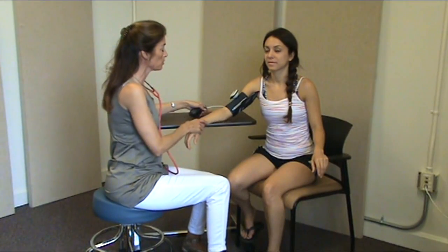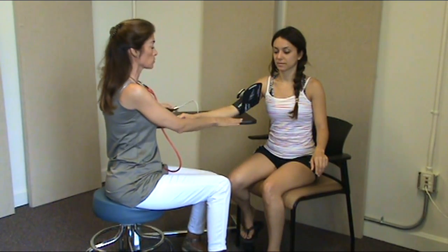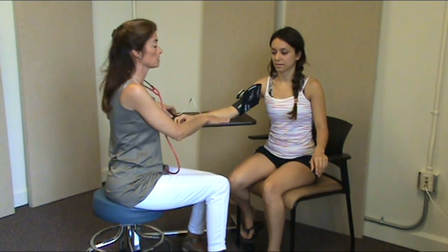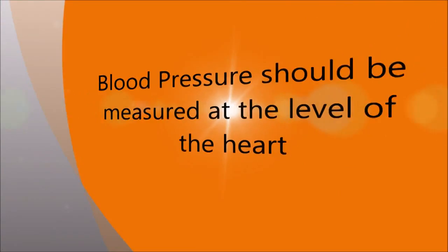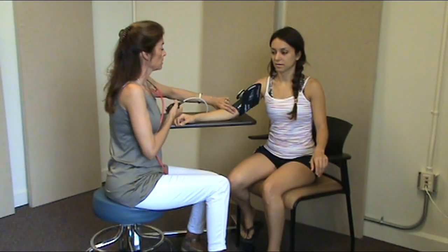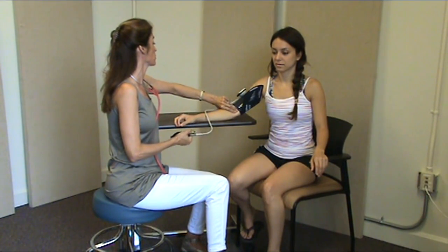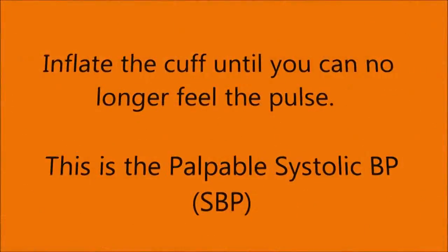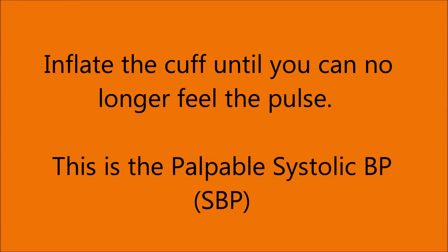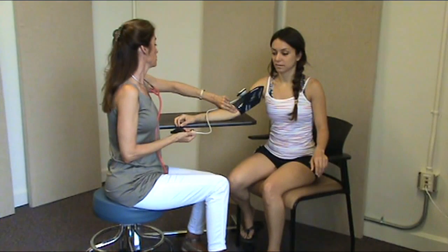Okay. So now to check a palpable blood pressure, you want to make sure that the arm is level with the heart. So that's why you either want to have it placed on a table that is at that same level, or you're going to rest the arm in your own hand. So in this situation, we're going to press the brachial artery, or palpate the brachial artery while we're inflating the cuff, and then slowly deflate the cuff. When you feel the pulse, that is going to be your systolic blood pressure.